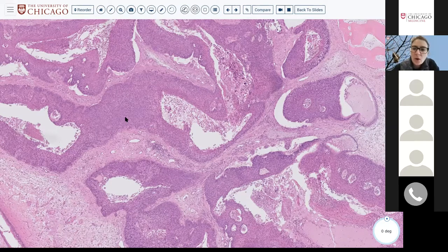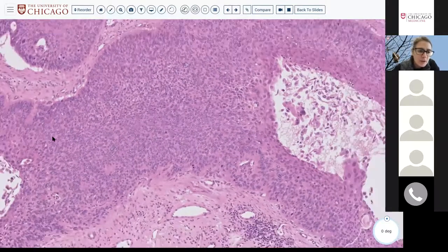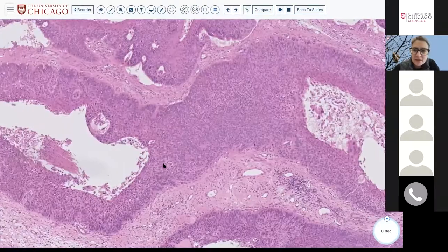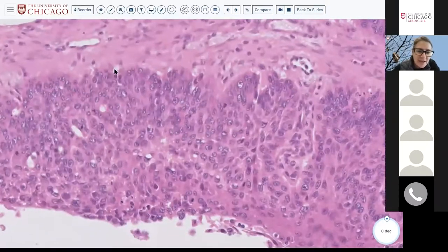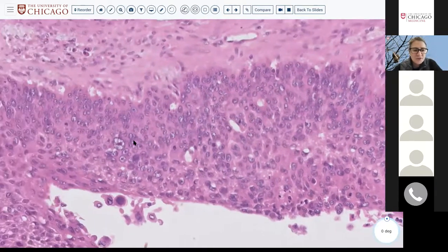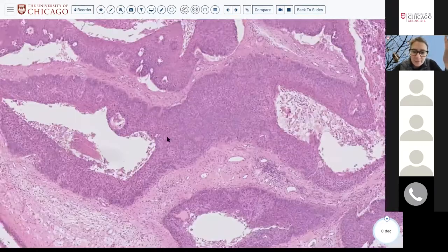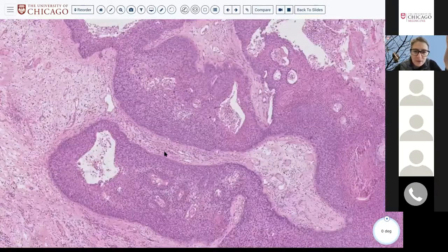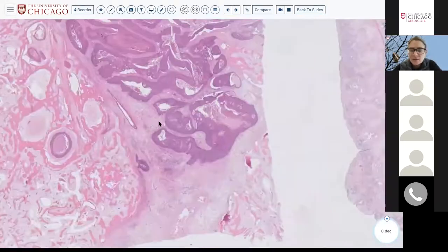So we already had a comment on the increased number of mitoses, absolutely. We have a comment on the presence of keratinization, certainly. And if you look at any one of these given nests and flip it top to bottom, I can't tell what's what, right? So to me, this is at least some suggestion of severe dysplasia or carcinoma in situ. And this is the exact problem with these sinonasal papillomas: look, here's a ton of pleomorphism towards the center of this keratin debris, and yes, invasion into bone, exactly.